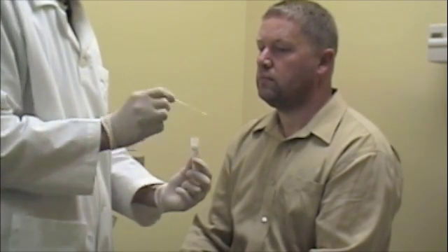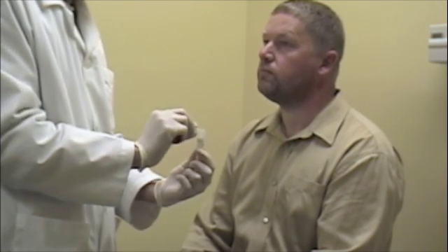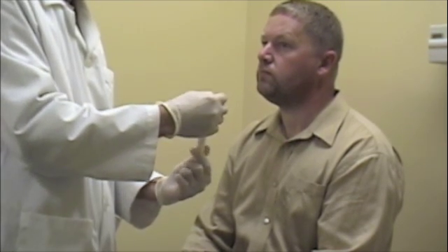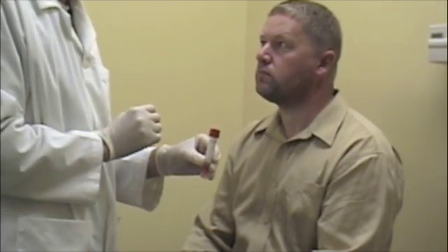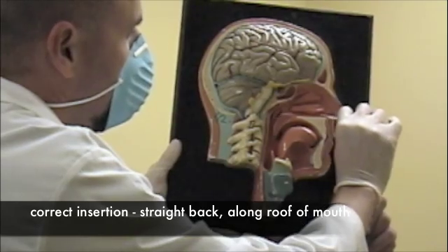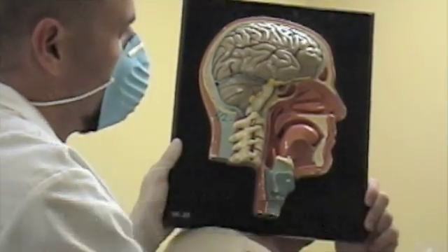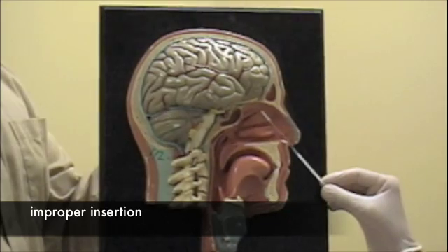Place the swab in the collection tube, snapping the end first. Label the tube with the patient's name and another unique identifier. Remember, the swab must be inserted straight back, parallel with the roof of the mouth. Do not insert the swab upwards.